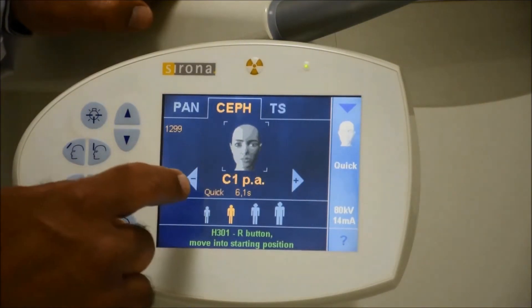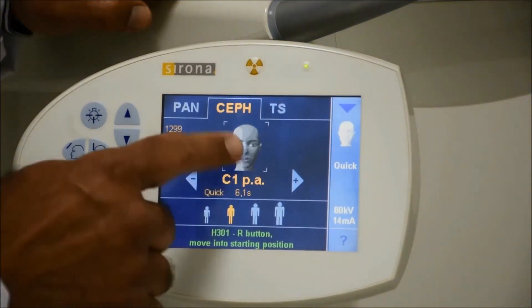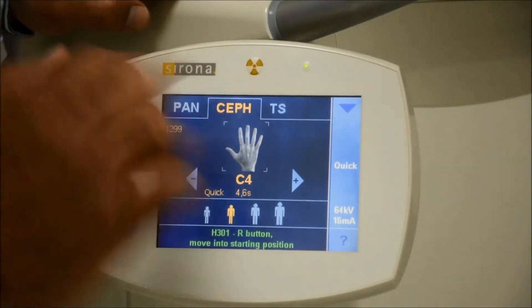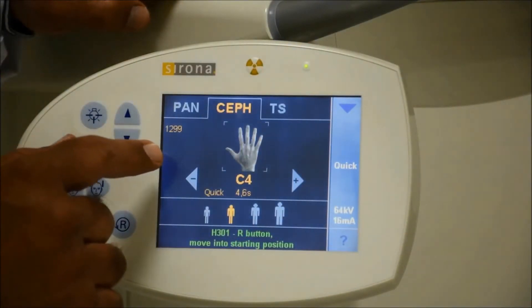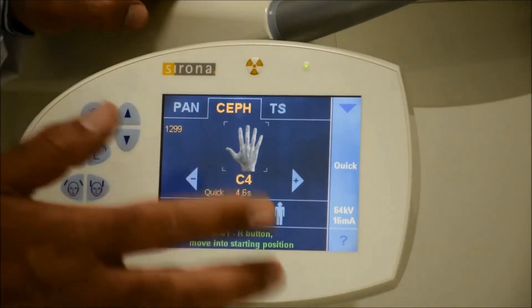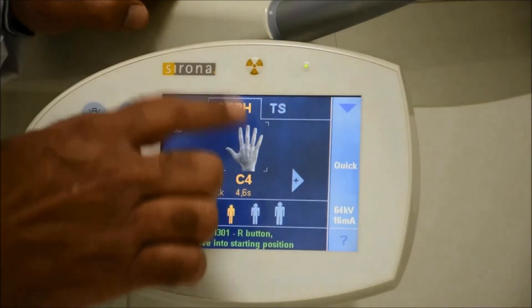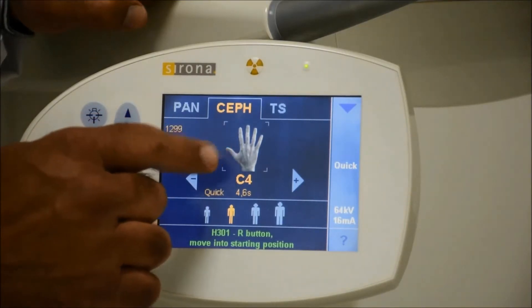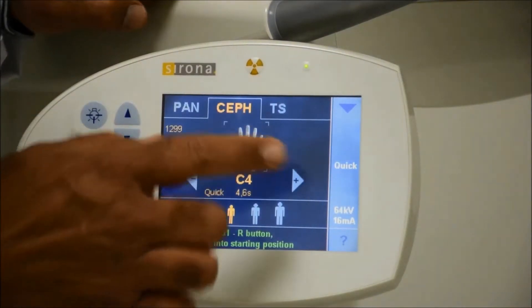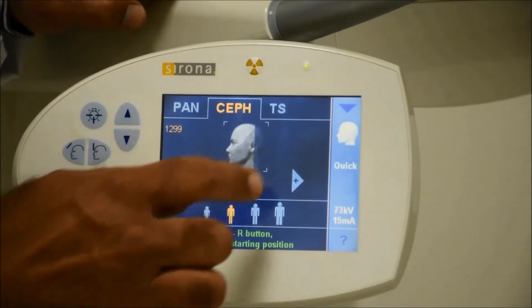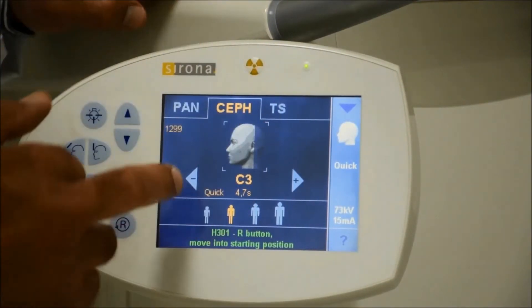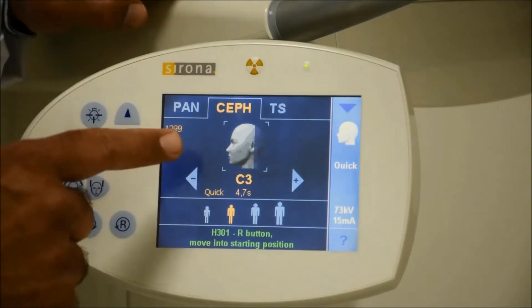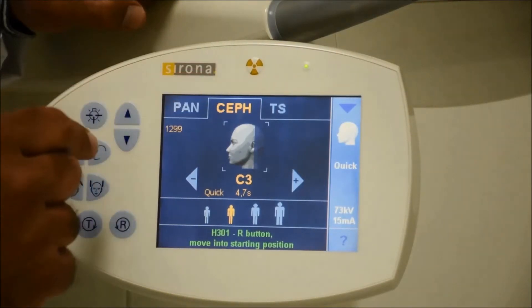The options available are: C3, C2, AP (anterior-posterior), C1 (posterior-anterior), and the hand/wrist view. The wrist is sometimes recommended by orthodontists to assess closure of the phalanges. The most commonly used projection is C3, which is the lateral ceph.